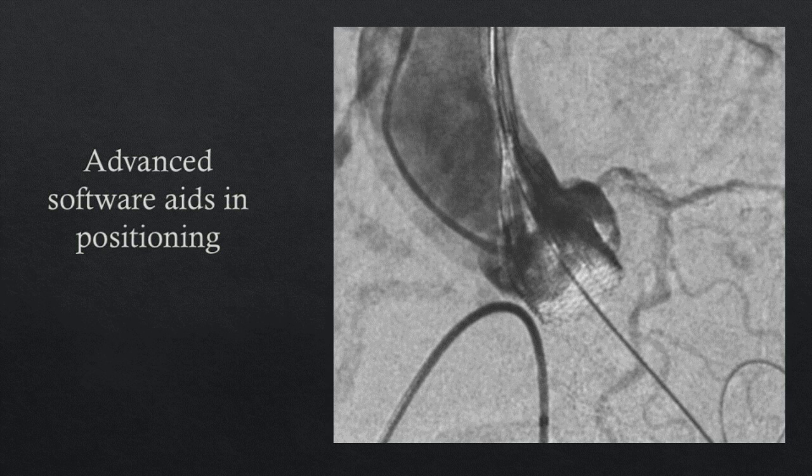This image shows the importance of adequate imaging during a TAVR procedure. In the next short clip, you'll be able to see how advancements in software can aid in procedural planning and successful device deployment. The pre-procedural CT is used to form a dynamic roadmap during the TAVR procedure. With this technology, previous CT imaging is fused and registered to the patient on the table. As the imaging changes, the 3D overlay will accommodate, lowering procedural dose, contrast, and case time, and improving overall procedural outcome.